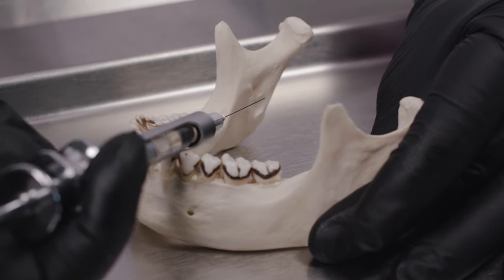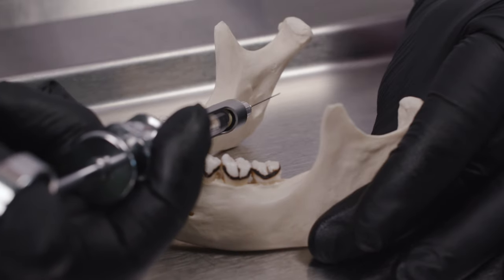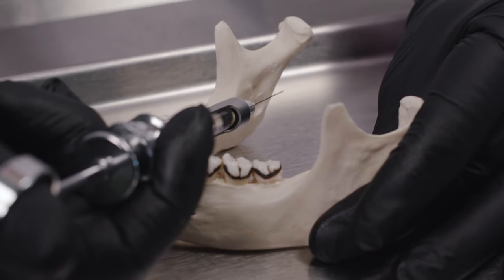If you don't deposit it there, the teeth will not get frozen. Your patient will not be numb, and you'll have to give another block, and maybe another. It looks easy enough. Now, how do you find this spot on a patient?